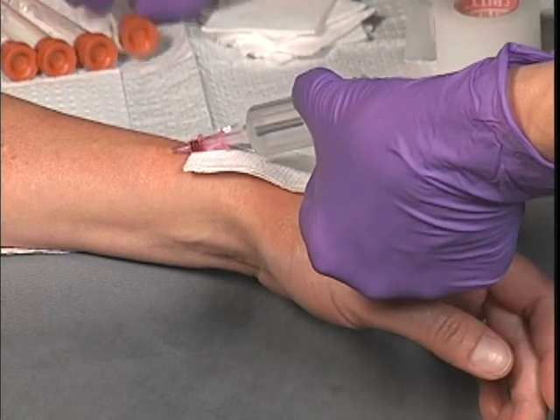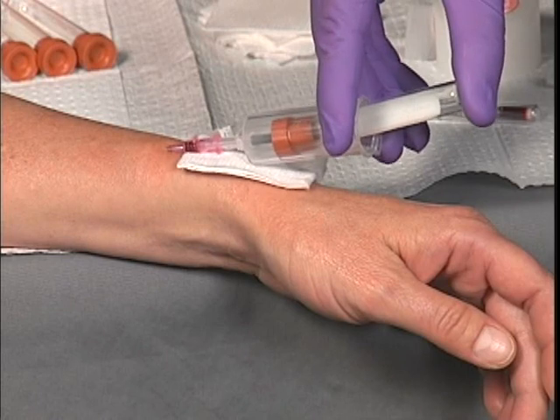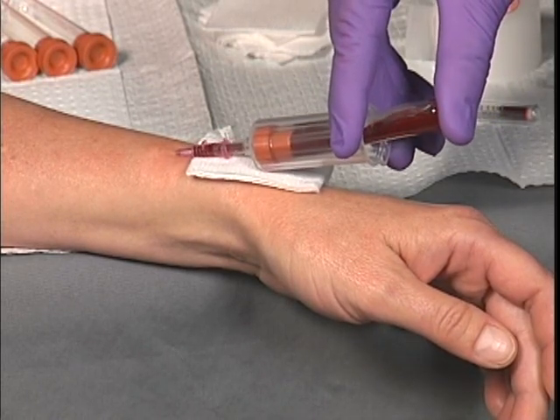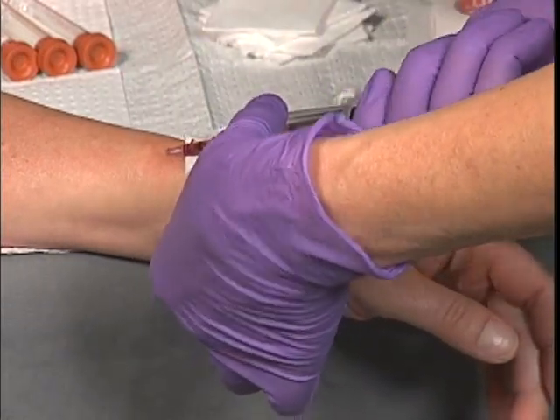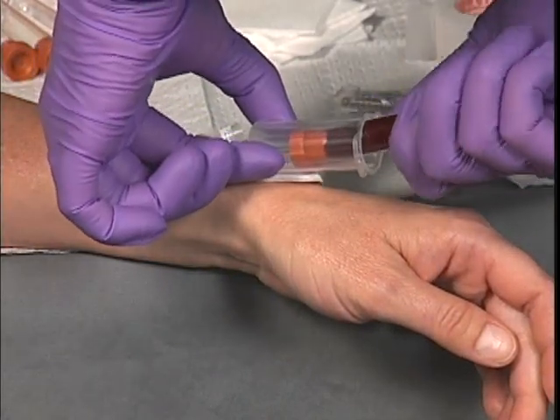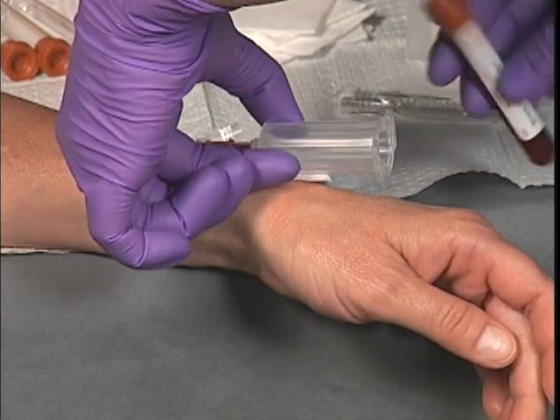For blood draws, leave the tourniquet in place. Apply the vacutainer to the catheter hub and use the flanges on the container to facilitate pressure when inserting blood tubes. Secure the vacutainer while switching blood tubes. After each blood tube is drawn, gently mix the tube. Follow your local protocols on blood draws.